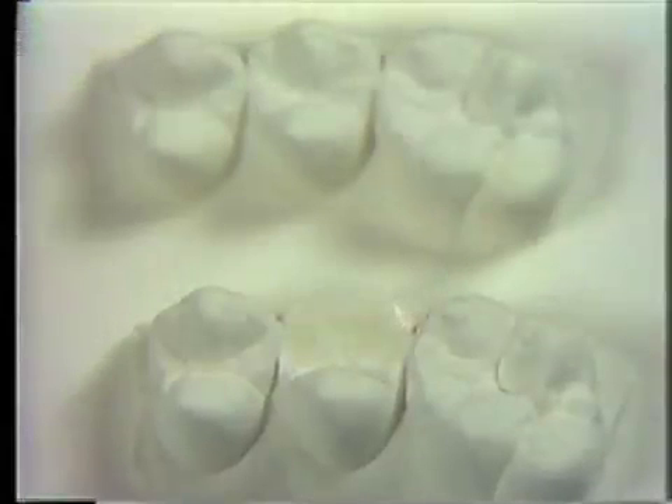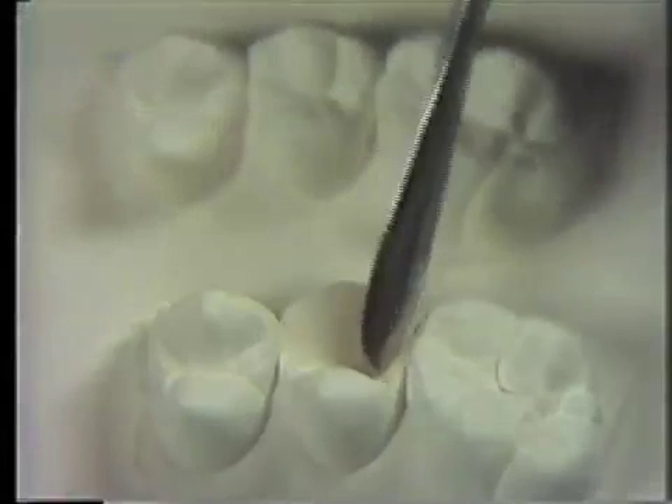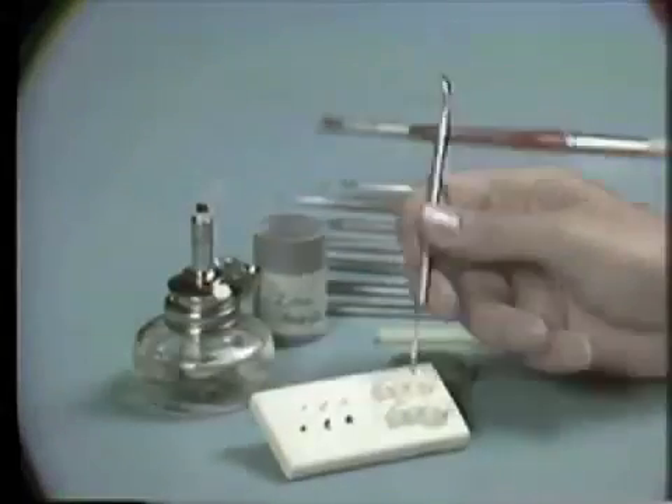A layer of white ivory wax should cover the future area to be waxed. Overheat the instrument so that the wax soaks into the plaster, preventing the wax structures from becoming dislodged later.